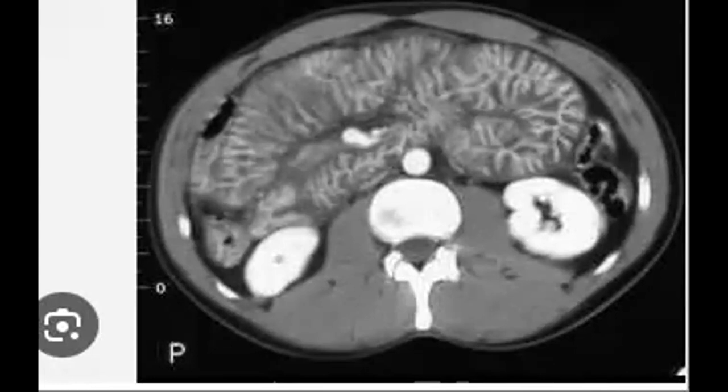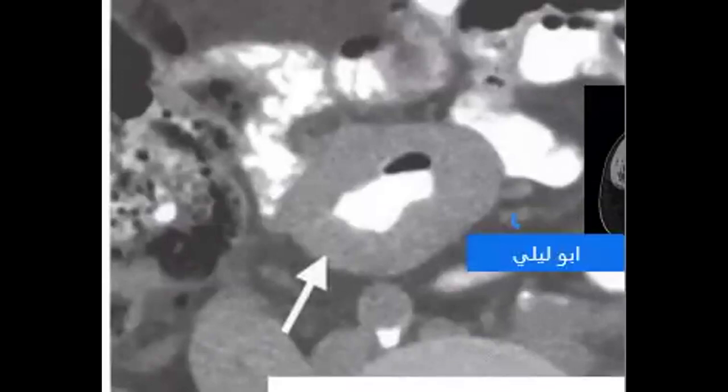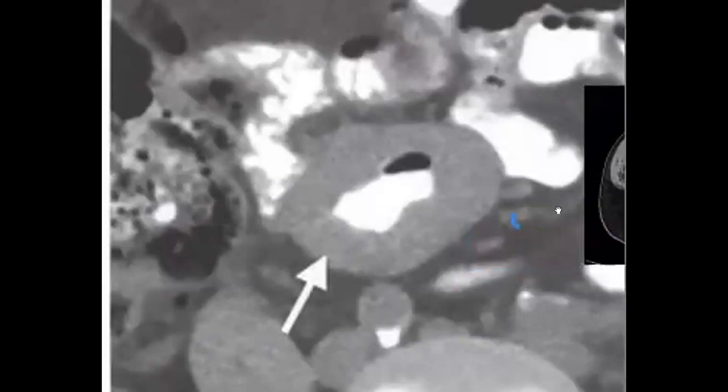Then if you shift with me, if you are following me in the crack, we were talking about this appearance. Also one of the exam questions, he told you that there is a thickening in the bowel. The patient may have a history of AIDS or autoimmune disease, maybe a history of Crohn's, usually the high risk factors.